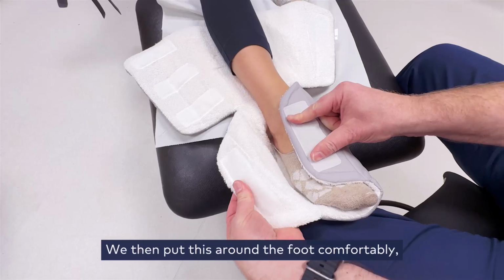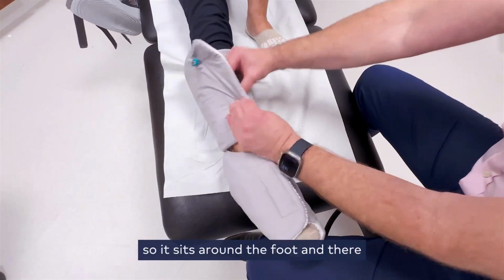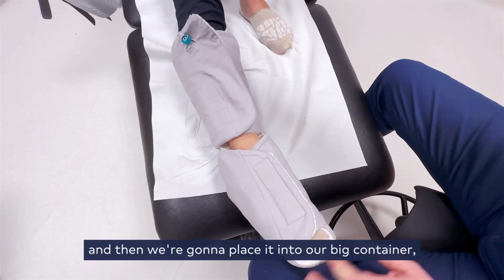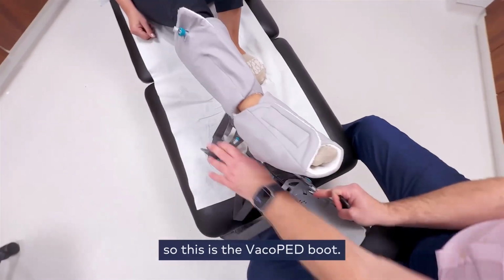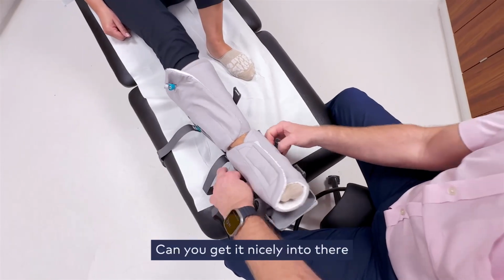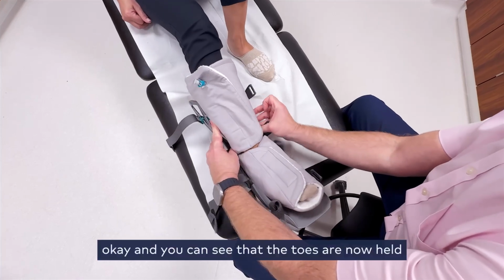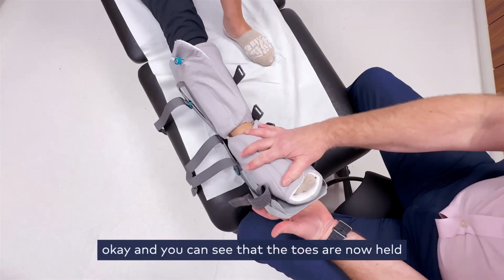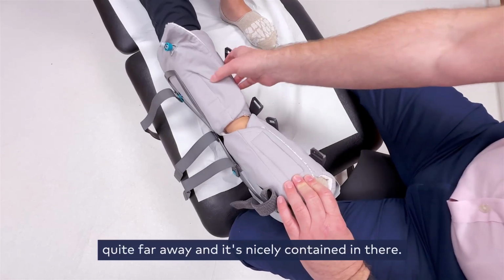We then put this around the foot comfortably so it sits around the foot and there. And then we're going to place it into our big container. So this is the VacoPED boot. And what we do is we try and cajole it inside. Can you get it nicely into there? Okay, and you can see that the toes are now held quite far away and it's nicely contained in there.